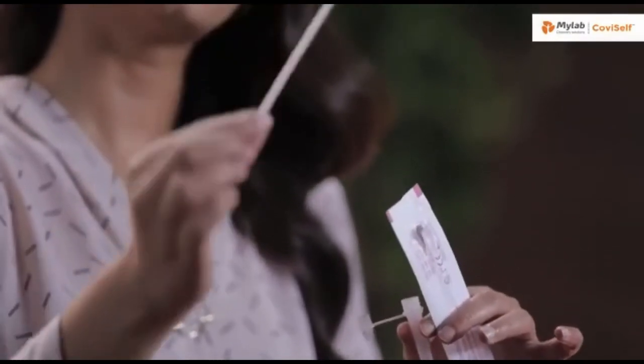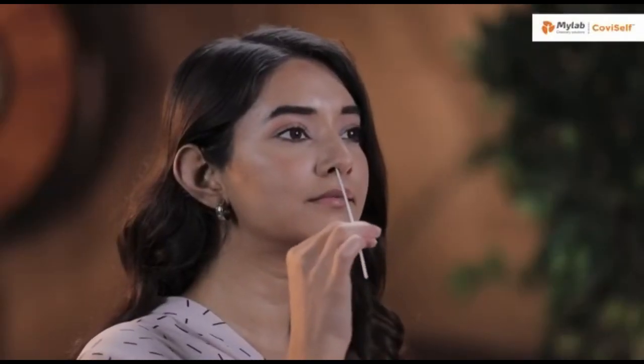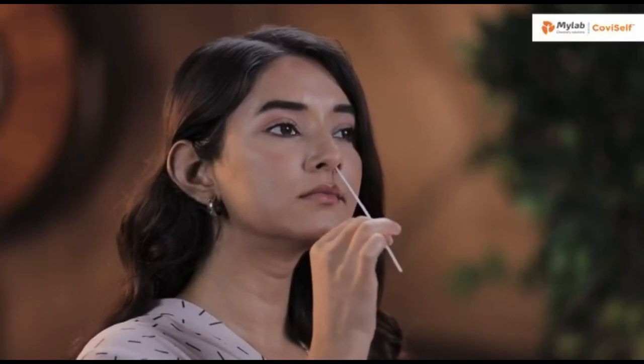It's important that you do not touch the swab head. Carefully insert the sterile nasal swab in both your nostrils one after the other up to 2-4 cm or until resistance is met. Roll the swab five times inside each nostril. Your nasal swab is now ready for the test.